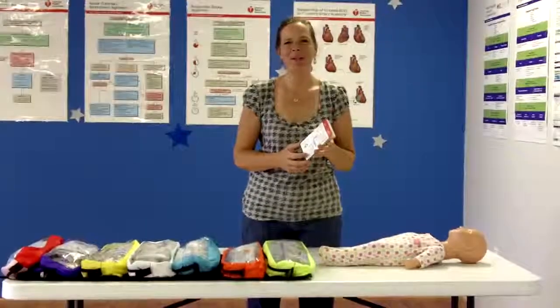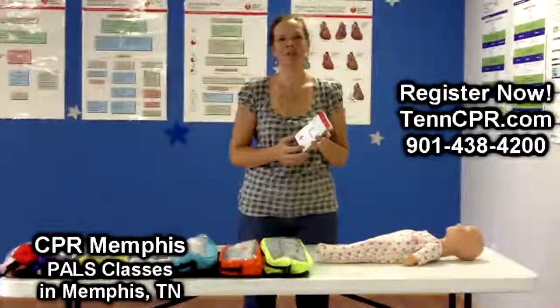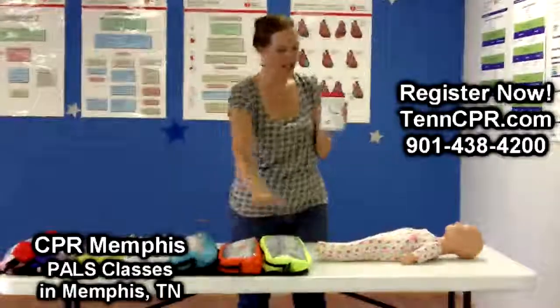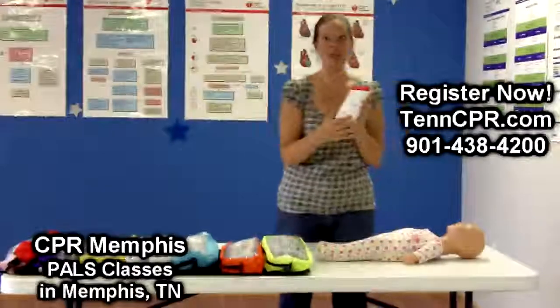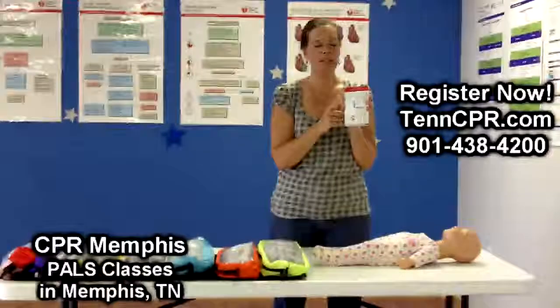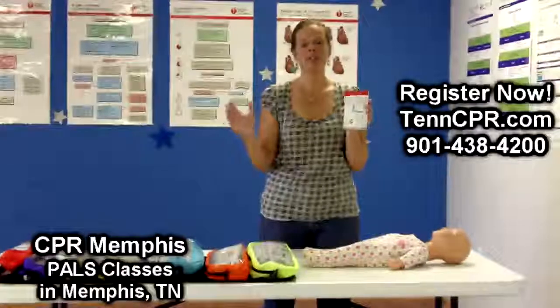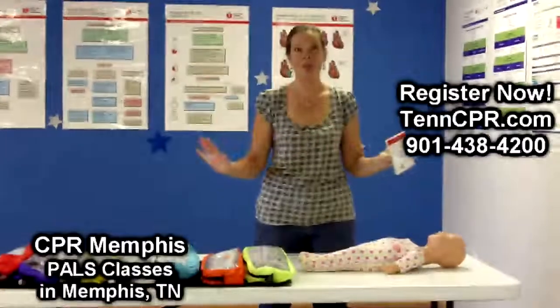Hello, today we're going over the Braslow Tape for PALS, which is the American Heart Association 2010 guidelines. We have the Braslow Tape, including the kit and a wonderful infant mannequin. Dr. Braslow and a team of doctors came up with this for emergency situations because we know with pediatrics it's a very stressful situation, and now we have simplified it so it is stress free.